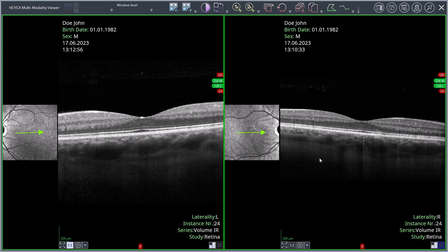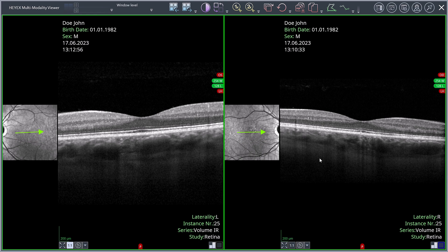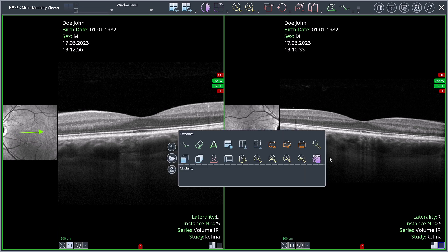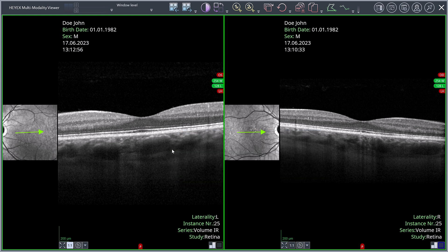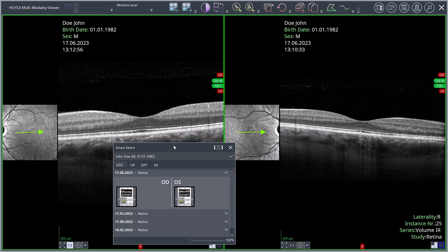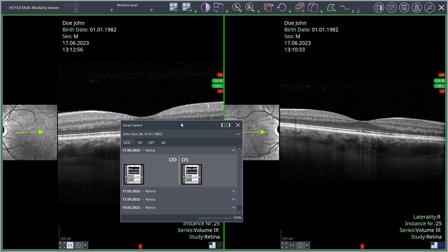To access further tools and images, right click an image in a viewport to open the context menu. Here you can adjust the favourites area according to your requirements. You can also activate the Smart Select function to access further images of the patient. To do this, click the Show Smart Select button. If required, you can anchor this window to the left or right side of the Multi-Modality Viewer by clicking the Dock Left or Dock Right button.